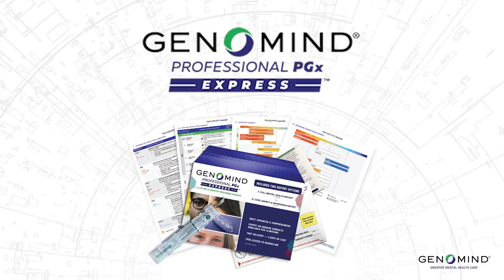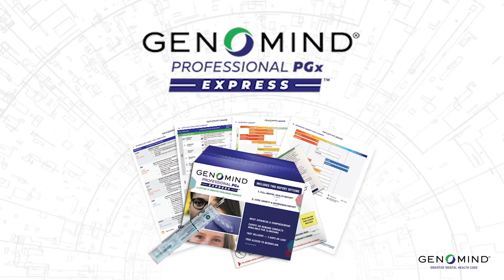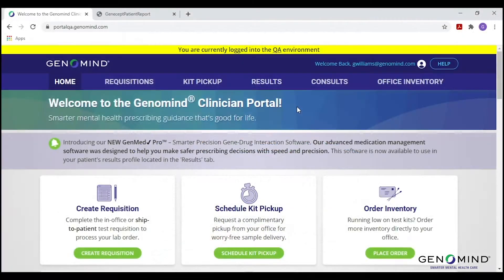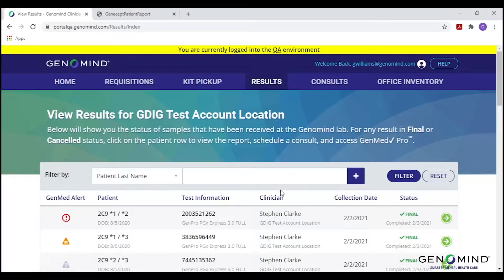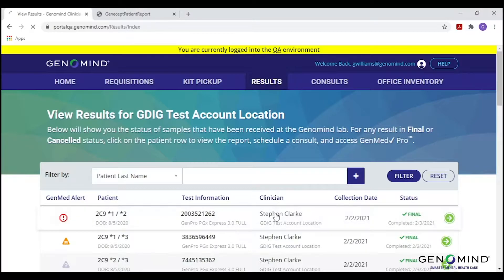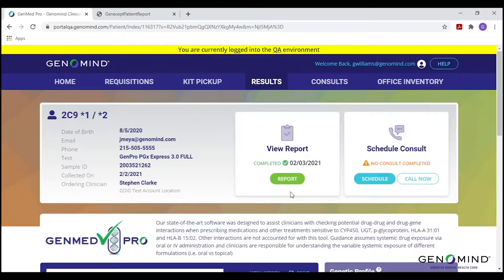Let's start by discussing where and how to access patient reports. All patient reports can be accessed and viewed through your GenoMind clinician portal. Once logged in, you will simply click on the results tab at the top of the page, choose the appropriate practice location as applicable, and then find or search for your patient by name. You will then be able to view that individual patient's report. To learn more about how to navigate the rest of the clinician portal, check out our clinician portal demo video.